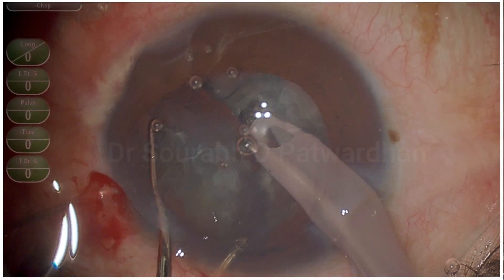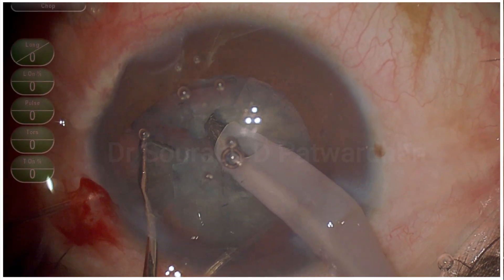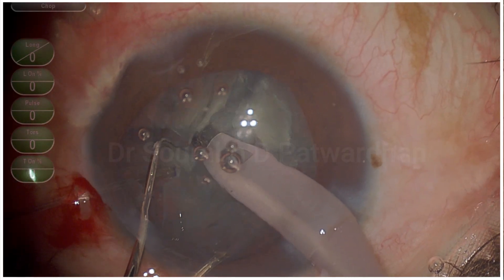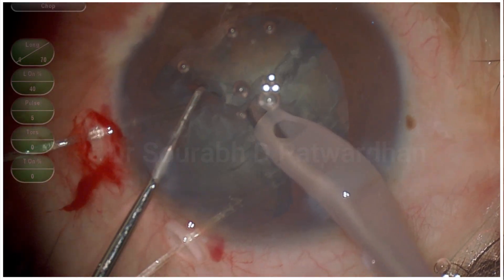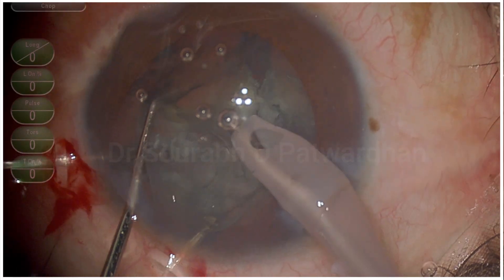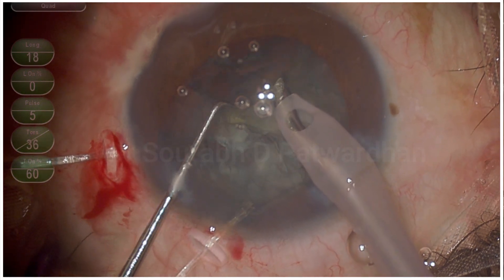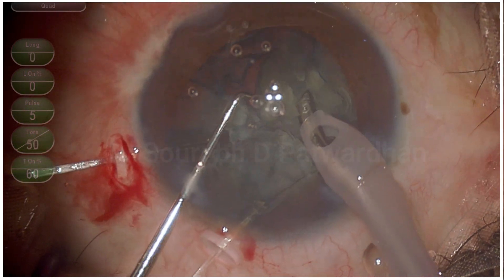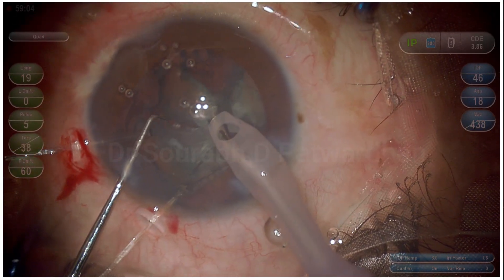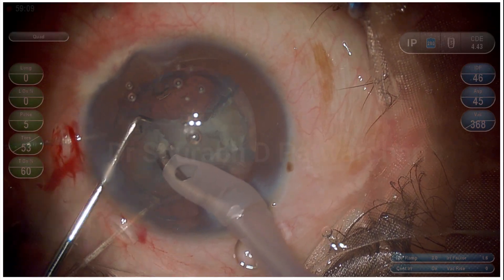Even if you put these capsular hooks, you have to make sure that you do very, very gentle phaco, good chopping, and no excessive pressure on the bag. Even while chopping, you can see I am not stretching it excessively because I don't want any further damage to the zonules. I don't want vitreous to prolapse if I push the nucleus downward when trying to divide it. Always make sure you are very gentle with the bag — the zonules should not know that you are doing the phacoemulsification. It's like stealing the nucleus out of the bag without the zonules coming to know.